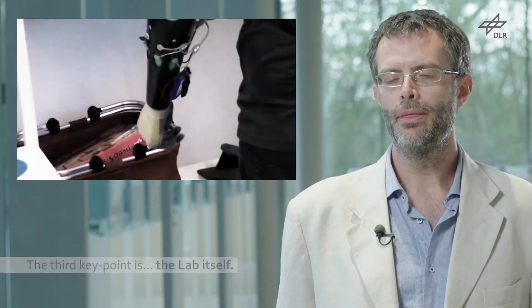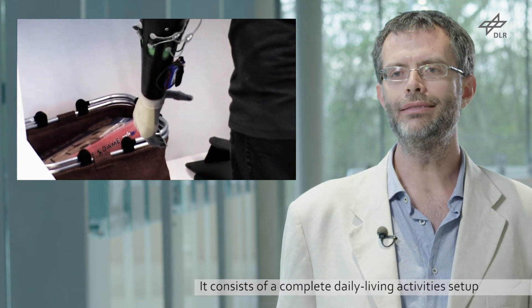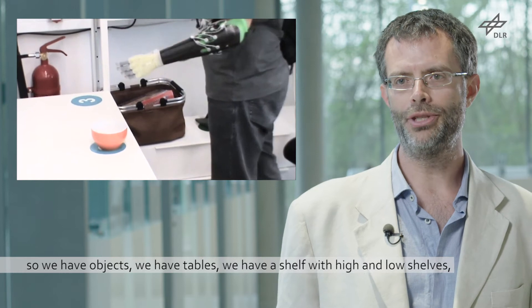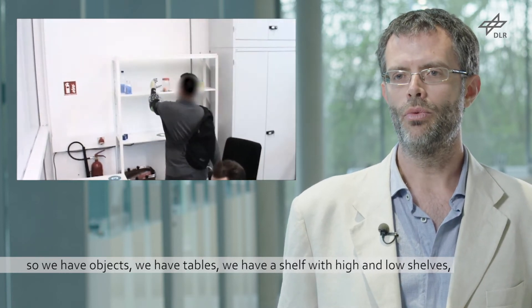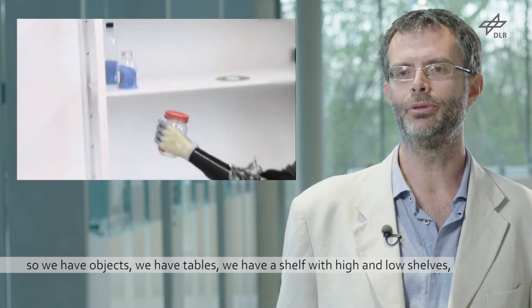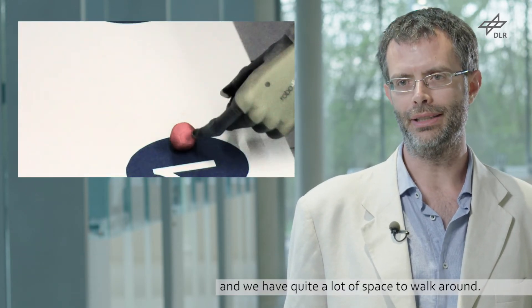The third key point is the lab itself, which consists of a complete daily living activities setup. We have objects, tables, a shelf in which things can be reached from the top shelf down to the bottom shelf, and quite a lot of space.